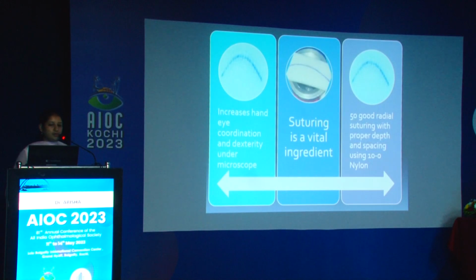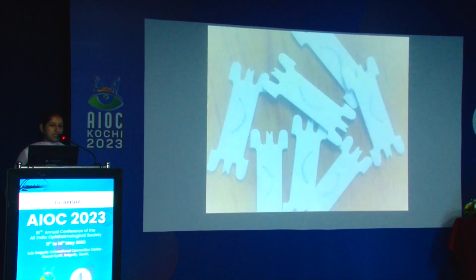We were advised to do suturing, which is a vital ingredient that will increase our hand-eye coordination and dexterity under the microscope. We were advised to do 50 good radial sutures with proper depth and spacing using 10-0 nylon during the initial days. These are what I practiced.